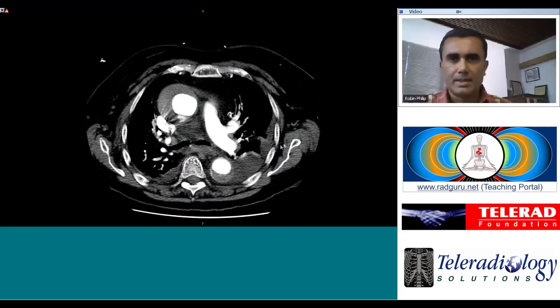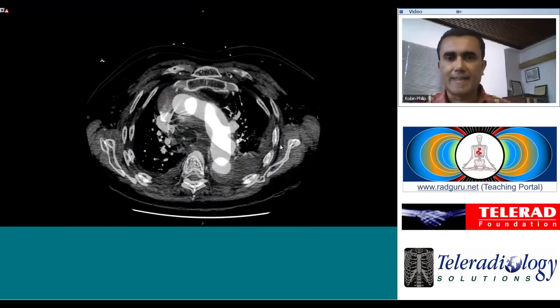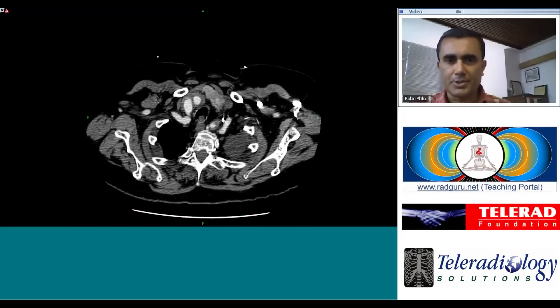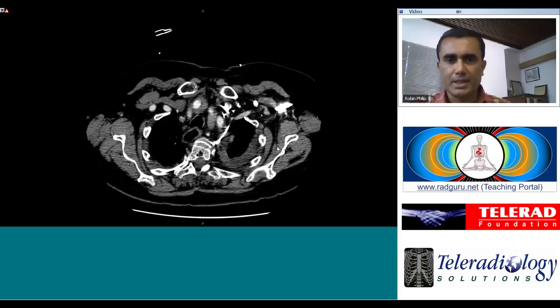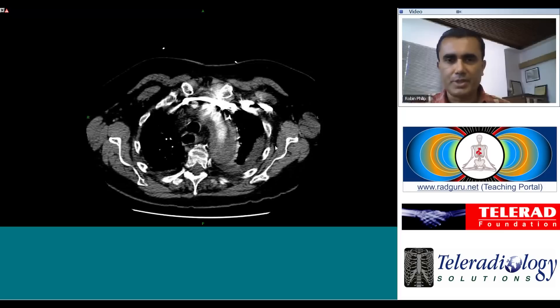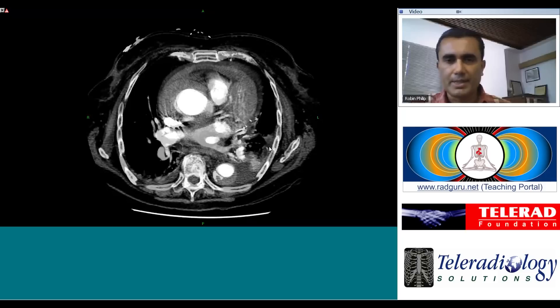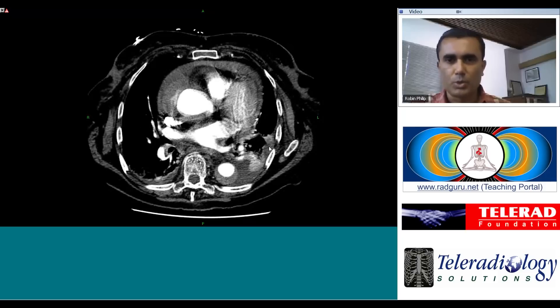This is a contrast CT scan of the chest in a patient presenting with acute onset of severe chest pain radiating to between the shoulder blades.